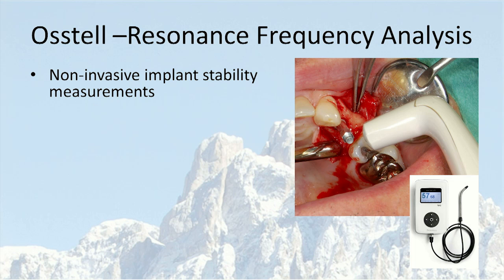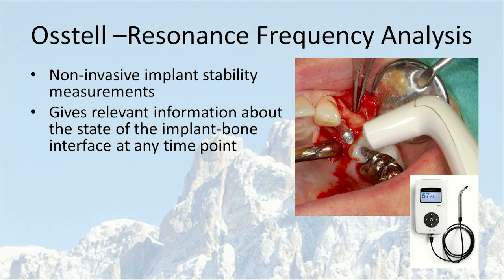And I would like to make some statements before we start here. This is a non-invasive technique for implant stability measurements. And we know now from 20 years of use and research that it gives relevant information about the state of the implant bone interface at any time point during the treatment and follow-up of the patients.